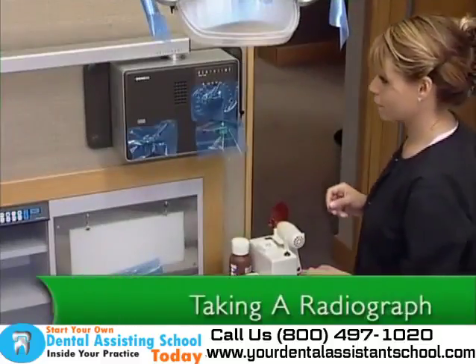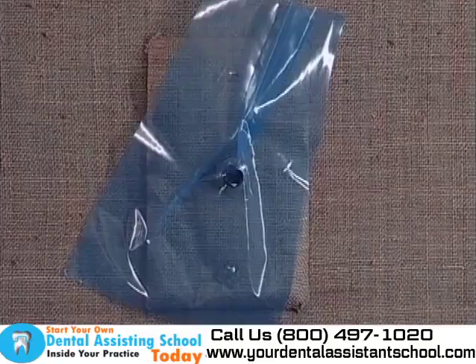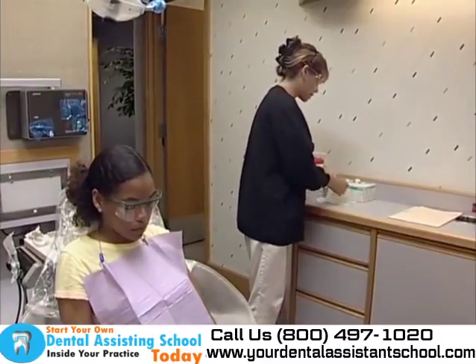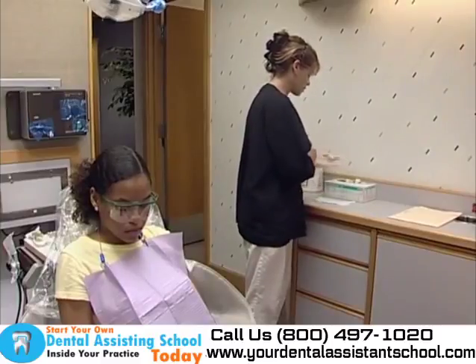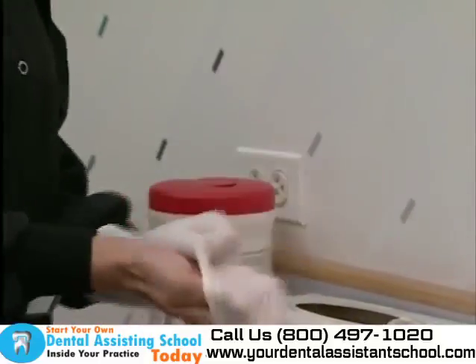To begin, the assistant confirms that the control panel, exposure button, tube head, and countertops are covered. This aids in infection control and helps prevent potential disease transmission. The dental assistant should wear the appropriate personal protective equipment: gloves, gown, mask, and protective eyewear.